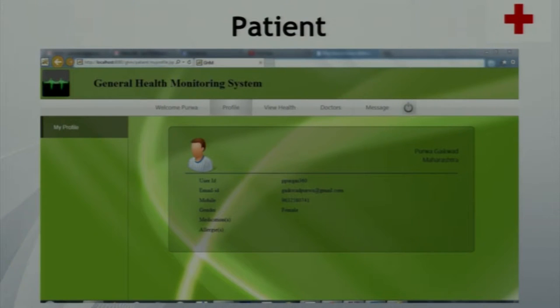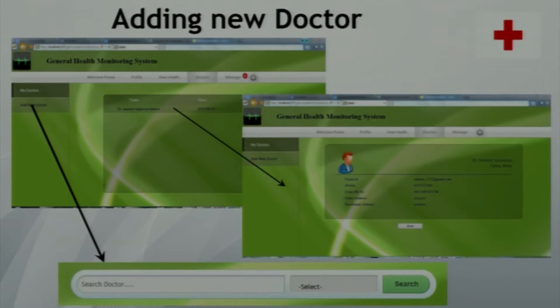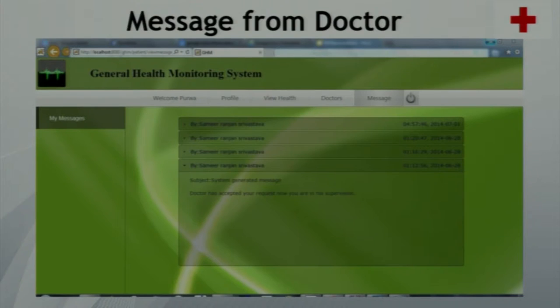When the doctor clicks on the request tab, all requests from patients are shown. He can view profile information and accept or reject a patient, or refer the patient to a different doctor without accepting the request. Coming to the patient interface: on the patient's welcome screen, all profile information is shown. When the patient clicks on the view health tab, he can see his health parameters in a similar way to the doctor. When he clicks on doctors, all doctors supervising him are listed, and he can also add a new doctor using the search tab.